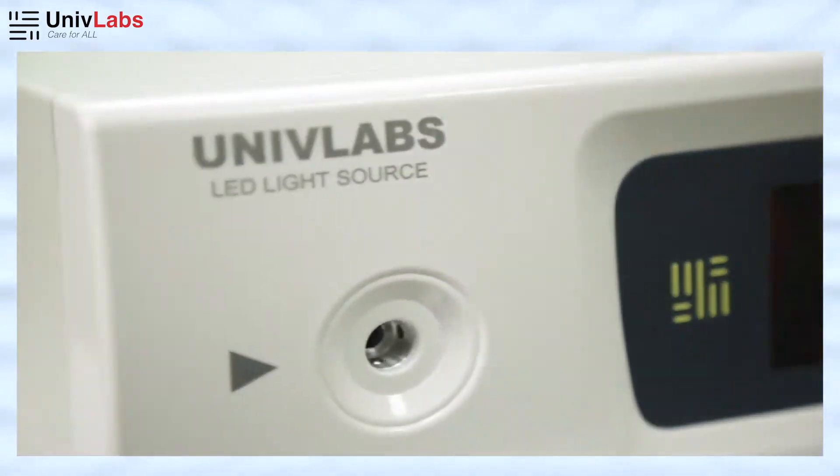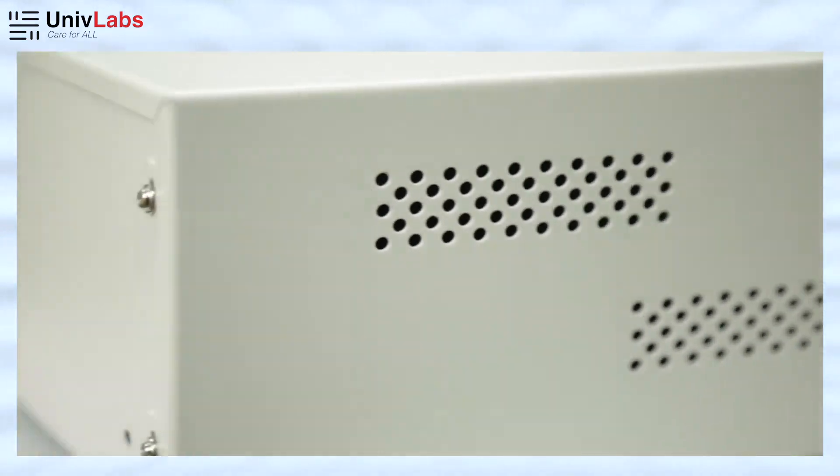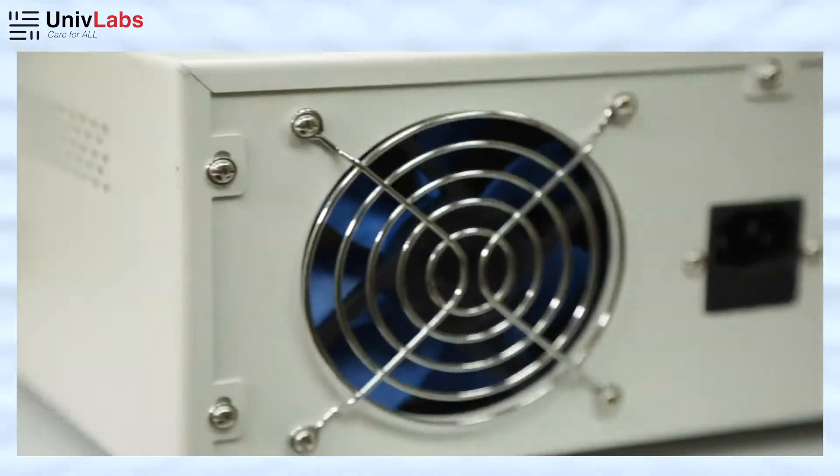Today we will discuss the features and benefits of the light source UL9000S developed by UnivLabs, used in laparoscopy and endoscopy surgery.